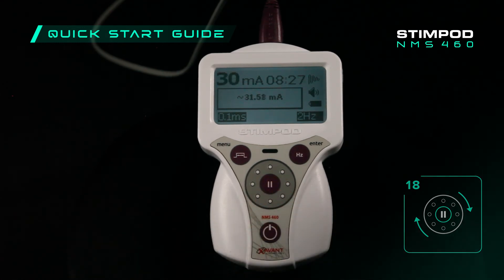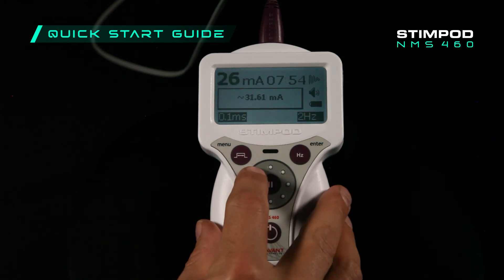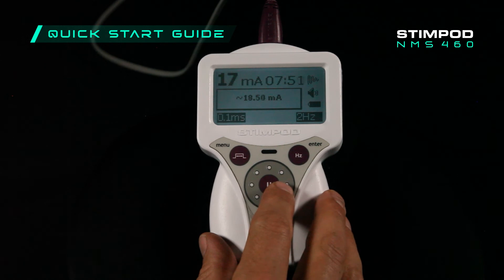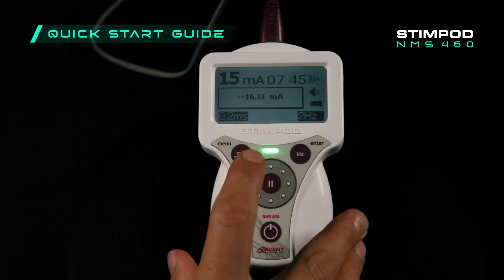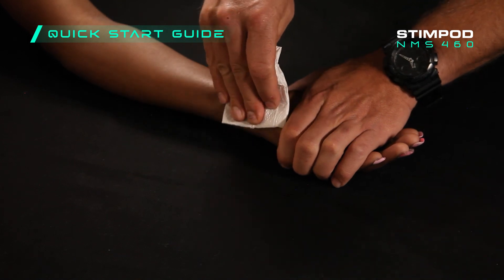If you reach the maximum current intensity of 30 milliamps at 0.1 milliseconds, you can readjust the current back down to 15 milliamps and set the pulse width to 0.2 milliseconds, allowing you to increase the stimulation intensity even further in order to treat severely neuropathic nerves.